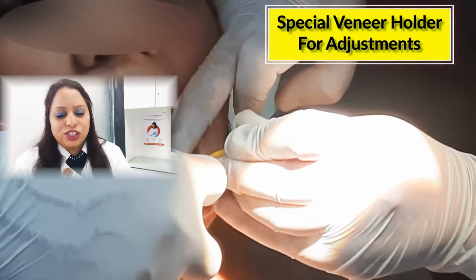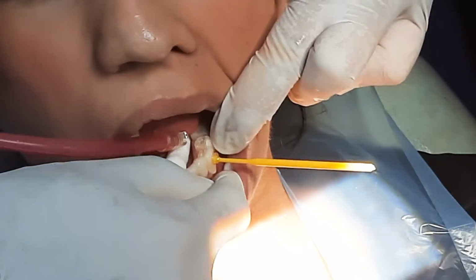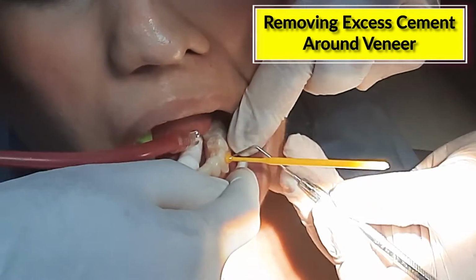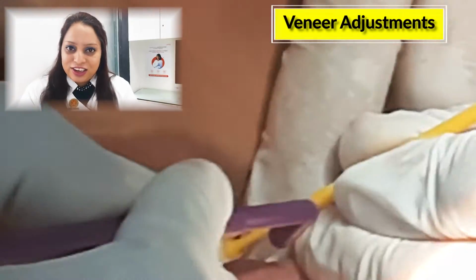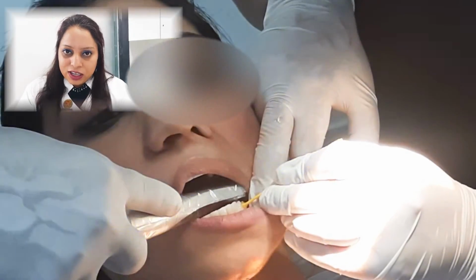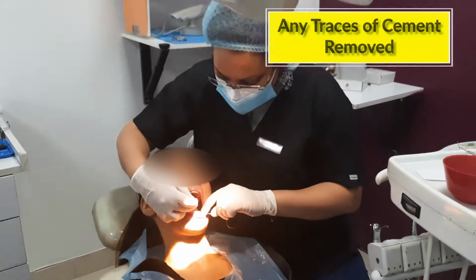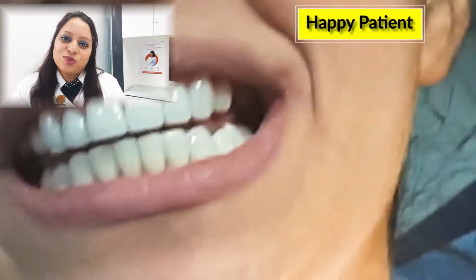And we have a glue stick also to hold the veneers because these are very fragile. And there is a special 9-step method that we follow for perfect bonding. So once glued, they will not come out and they last permanently.